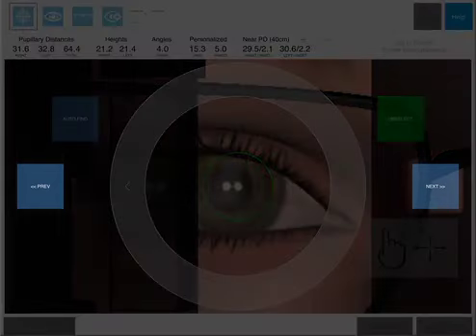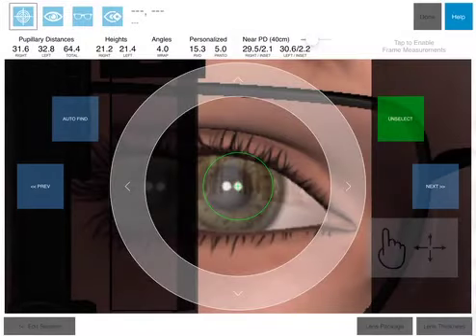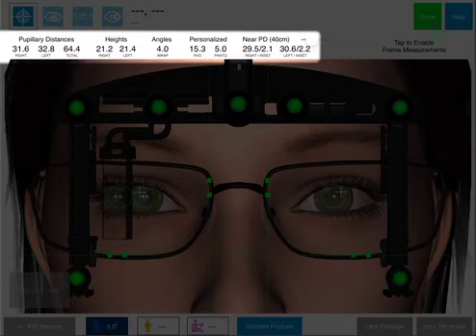Use the Next and Previous buttons to quickly jump between all available measurement markers. Once all markers are set, tap the Unselect button to return to the full screen view mode. All measurements required to order your lenses are now displayed in the results bar.